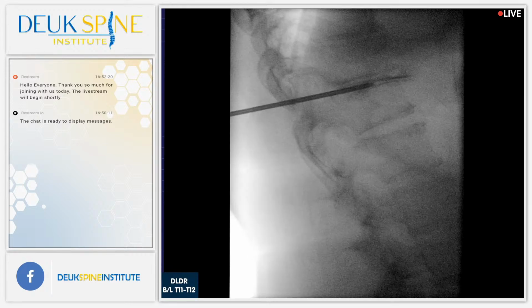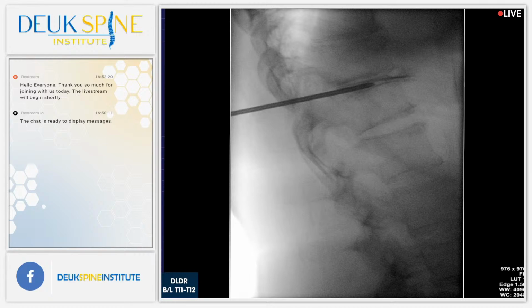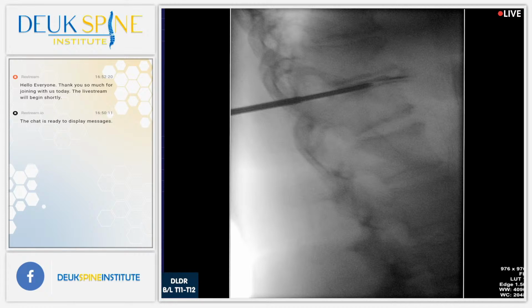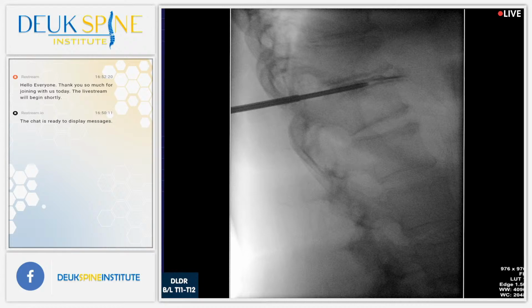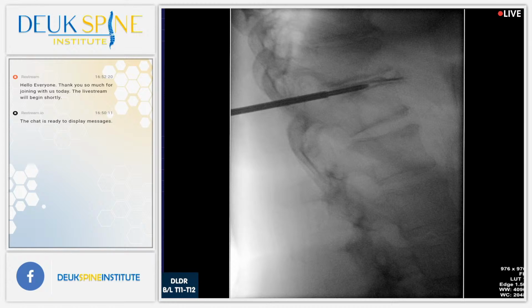Again, because she has a fracture at the end plate there, you can see it. That's right where we're working. And having a bigger scope, it's kind of being forced down into the top of the fracture, which we saw last time, and we don't want to do that again. We're going to try to avoid it if we can. The smaller tube and scope should help me steer a little bit better clear of her old fracture. Shot. Disconnect the other one.